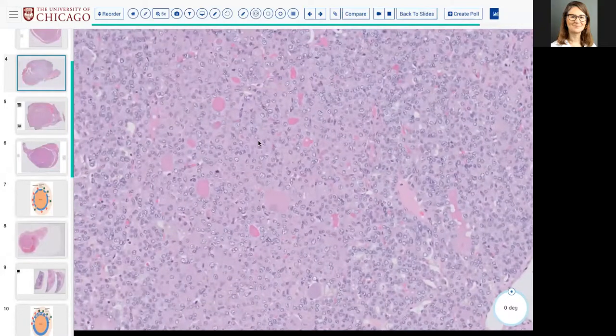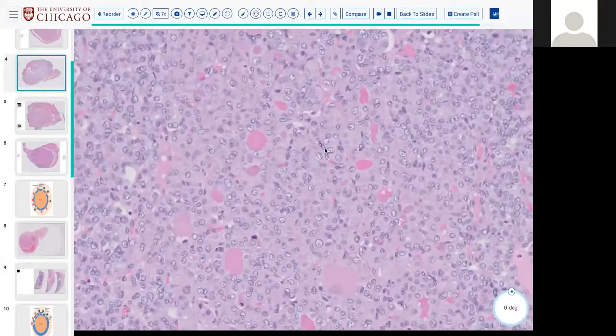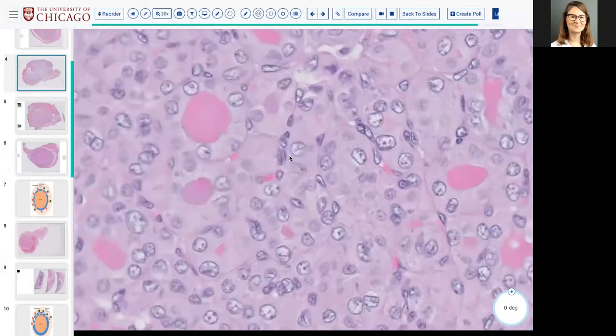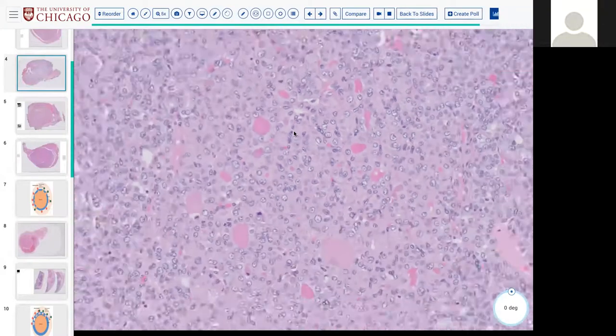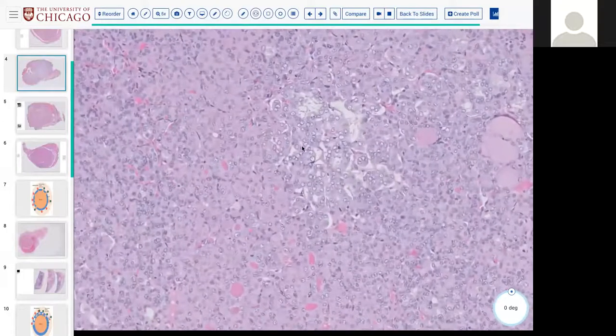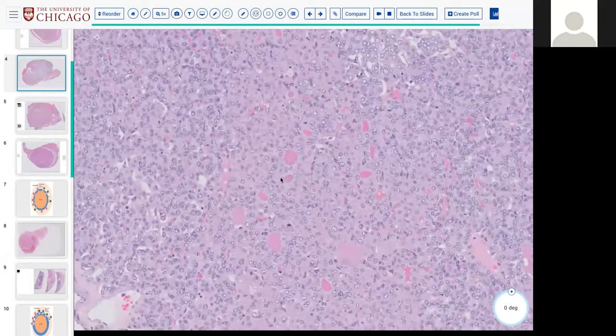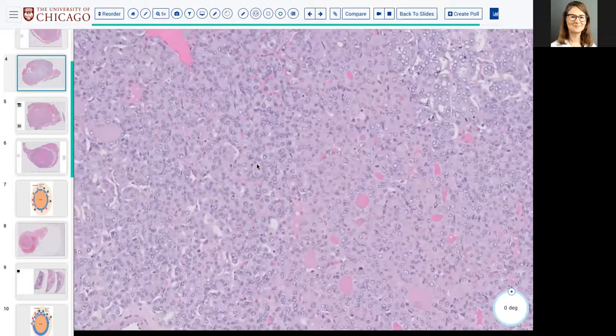I wouldn't necessarily refer to this as squamoid, because thyroid follicular epithelial cells can have moderate to abundant amounts of eosinophilic cytoplasm. Yeah. Looking at it again, assuming this was what I saw, I don't remember for sure, but I think these are obviously just follicles that are squashed together with plenty of cytoplasm. So good. Hopefully this is not what I saw. Hopefully it was some other overly zoomed in area that I got carried away with. Got it. Yeah.